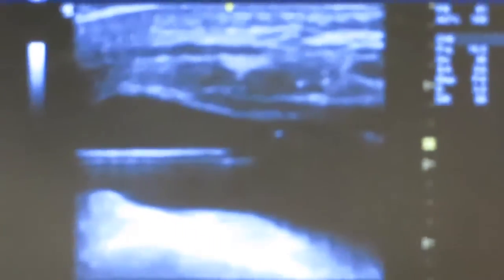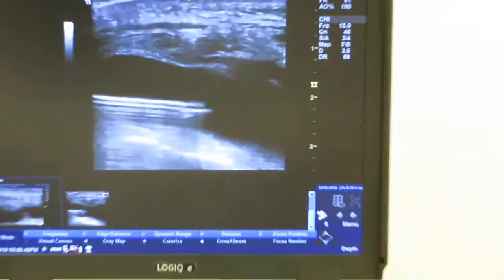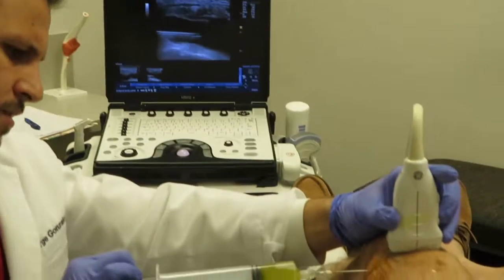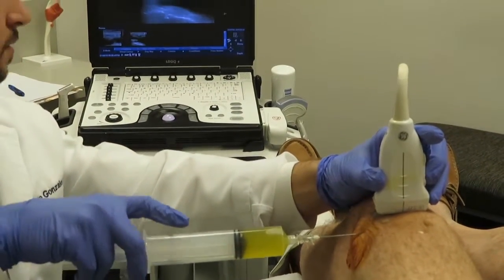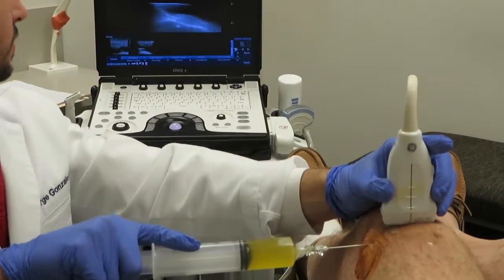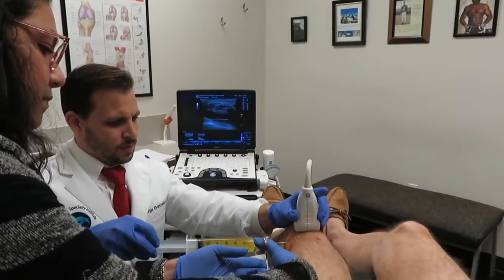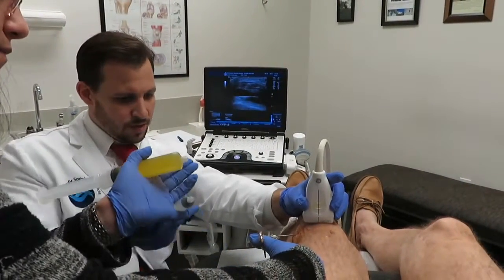We'll video that and you can see my syringe getting filled with all of that fluid in there. It's going to have a lot. My nurse is going to switch and get another syringe without having to move my needle inside.